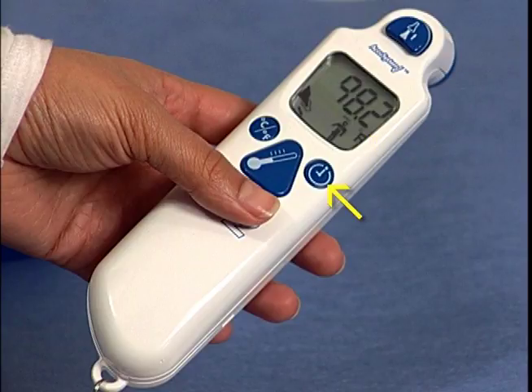The pulse timer button, located to the right of the large triangular scan button, displays a 60-second stop clock.